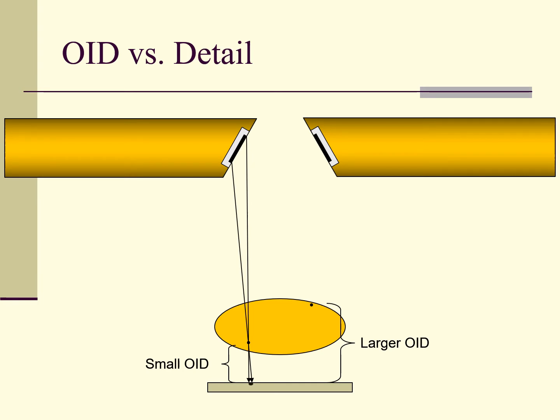Now, let us extend the rays from the top and bottom of the focal spot for the left anode and observe the image projected on the image receptor. I chose these rays because they represent the extremes of divergence. In reality, there are X-rays emitted along the entire length of the focal spot.